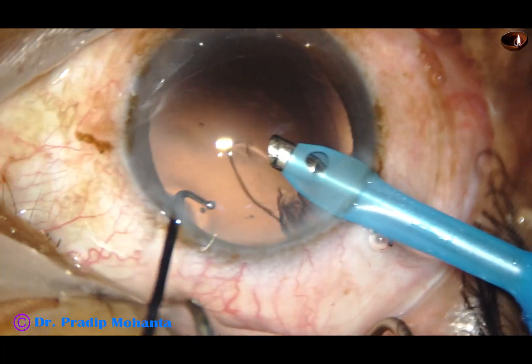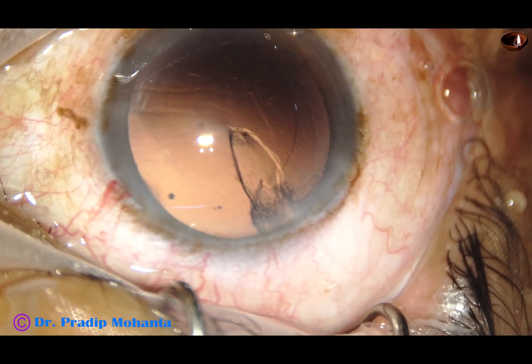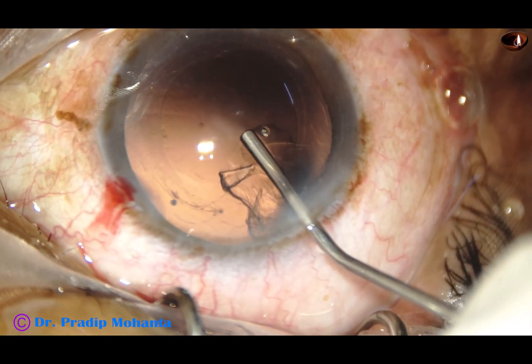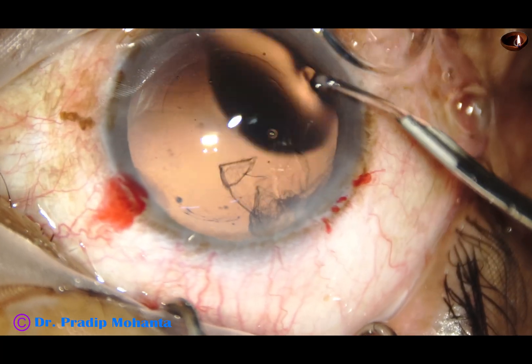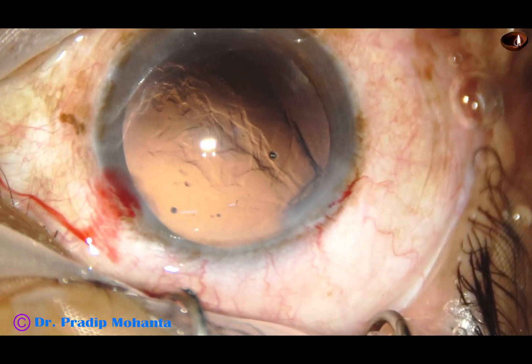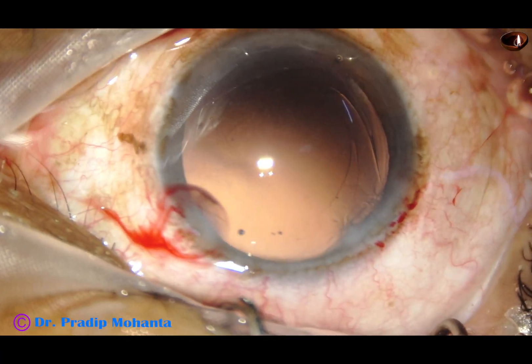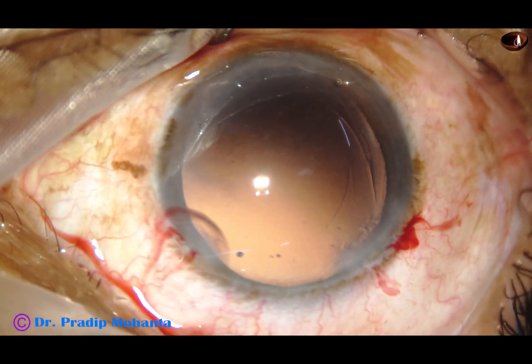You can remove a part of it and just practice. I didn't remove the sub-incisional cortex because it was becoming dangerous to do that. Fill out the visco and now see how with the SIMCO you can remove this — just go, turn it, hold and remove. The anterior chamber is filled up with visco. The SIMCO is not going to touch the cornea in any way. Fill up the anterior chamber with visco again and implant an intraocular lens.